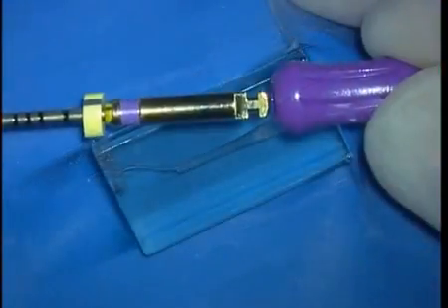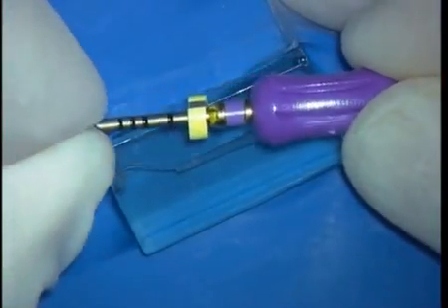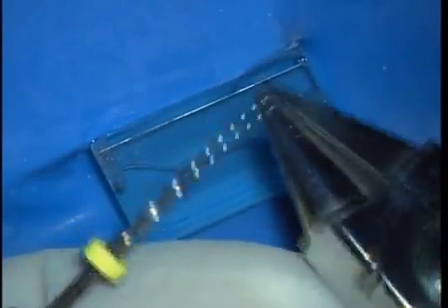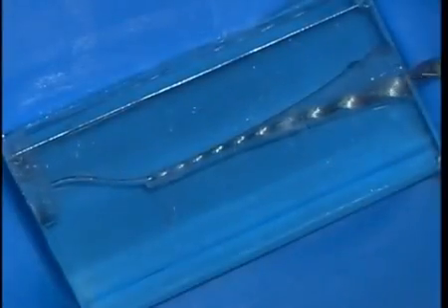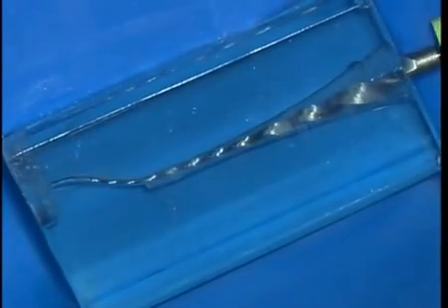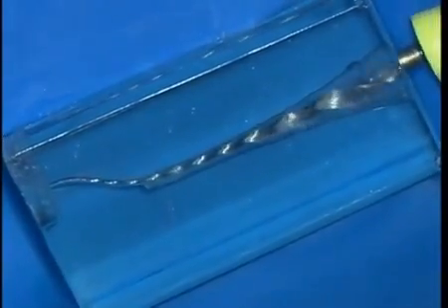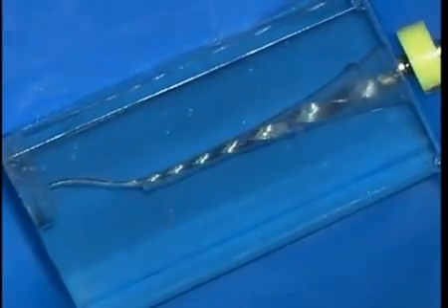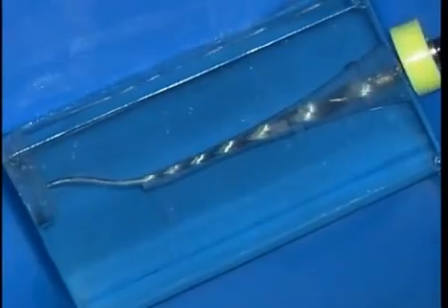The Shaper 1 is converted from a rotary instrument to a manual instrument, and again, its apical extent is pre-curved. The pre-curved instrument can easily move through the pre-enlarged canal, and its terminal extent can be moved past the ledge, and the instrument is rotated, or you can use a reciprocating handle motion until the instrument achieves length.